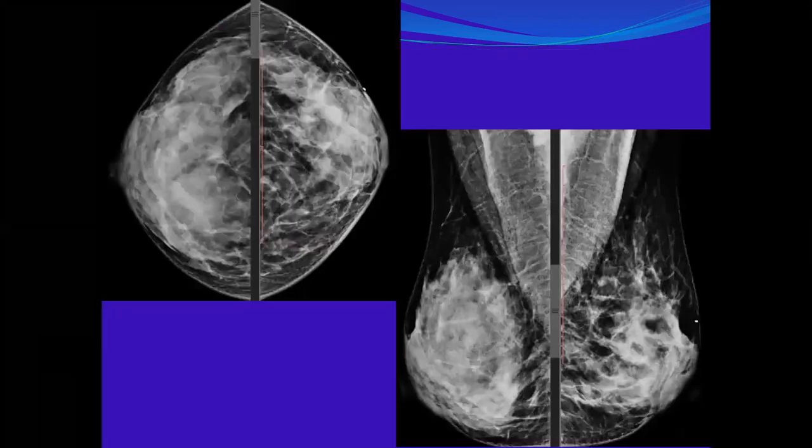Okay, what about this? Sarah, since you are there, tell me about this case. At the right breast, the whole right breast, there is a global asymmetry. Excellent, well done. I can see it at both the CC views and the MLO. So this is a case of global asymmetry. How are you going to manage the patient? How are you going to report this case? Just report it as global asymmetry?